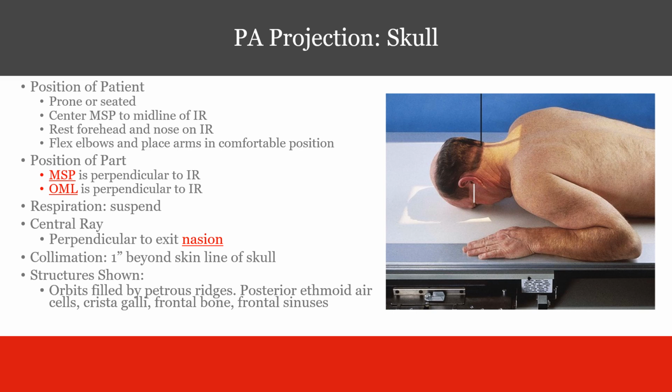Now to move on to a different projection, we're looking at a PA projection of the skull.